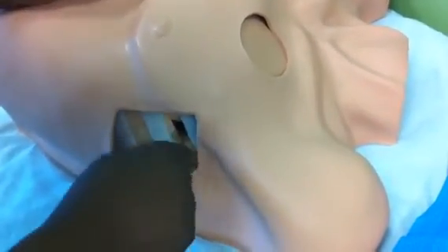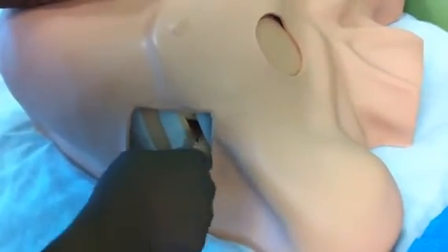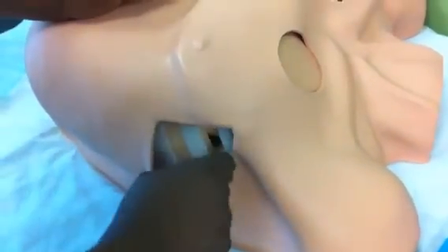I get my tube, clip it onto the forceps, and come back. We're going to put the tube in now. Using the forceps as a guide, I go just a little bit below and come out with the other forceps as I go in with this one. Once I feel that I'm in, I take the forceps out and push the thoracostomy tube in all the way — past the last hole, about 2 cm — to be sure all the holes are in the pleural cavity.